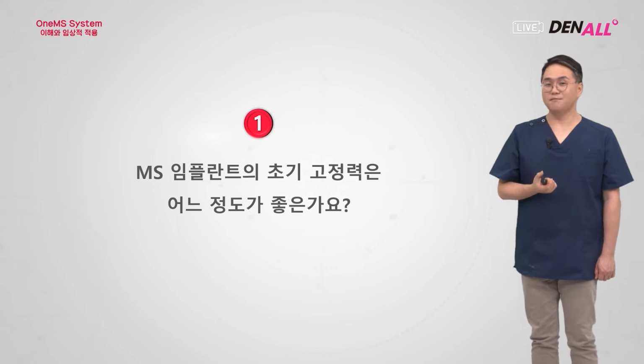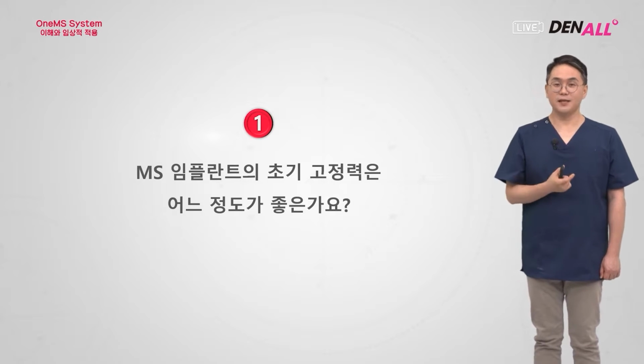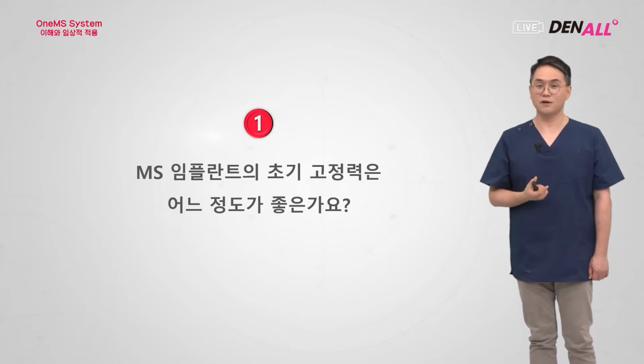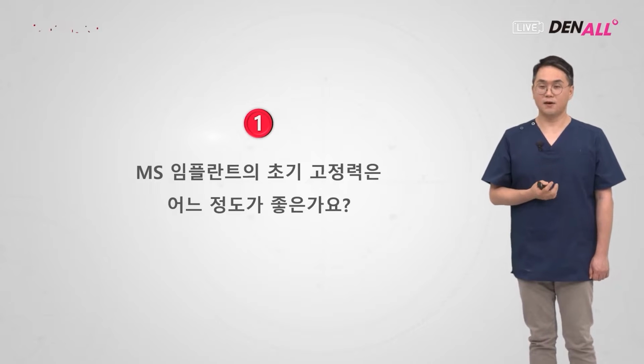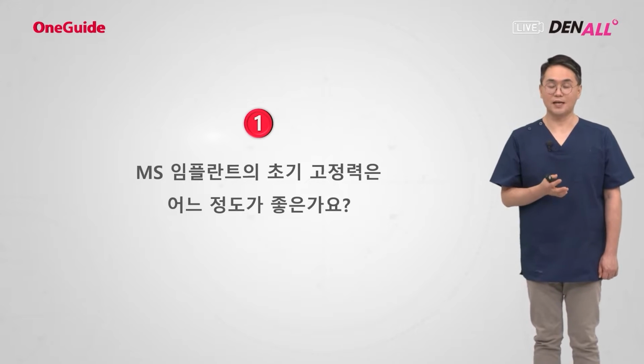When placing an MS implant, what the initial stability should be is a question I was often asked. For the same STS type implant, 30 to 40 newtons would be sufficient for immediate loading. So on the lower anterior part, when placing an MS implant, you don't have to worry about initial stability too much because the bone quality there is good.